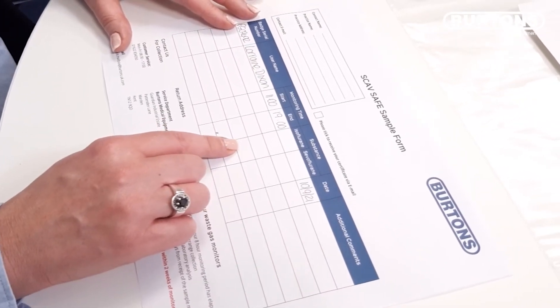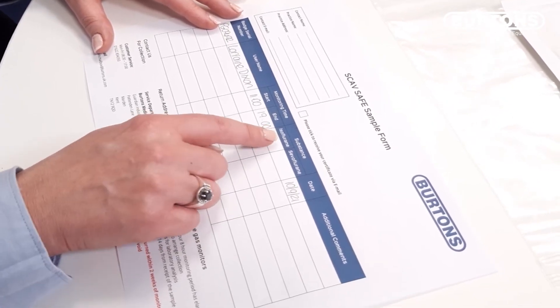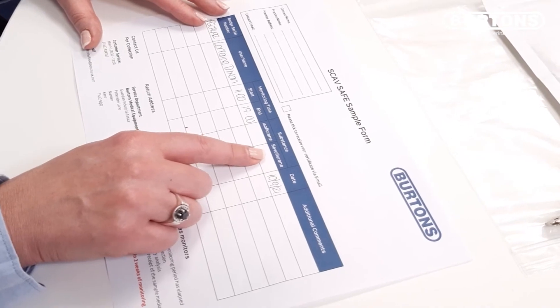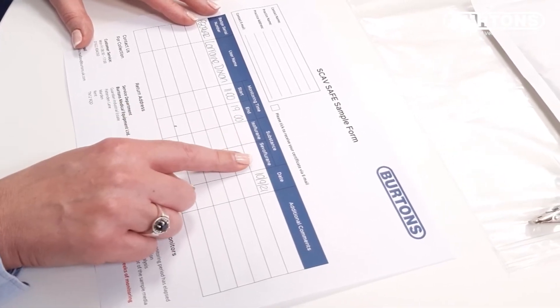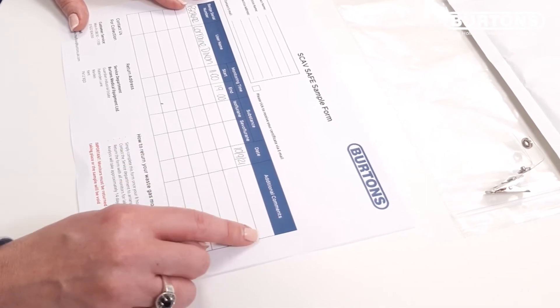Indicate on the form the substance you wish to be monitored for: isoflurane, sevoflurane or both. Any additional comments you wish to make, please enter here.